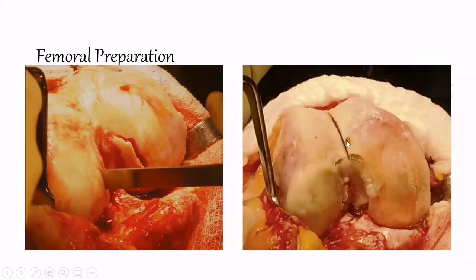This is the point that we drew with the preoperative alignment in the previous lecture. In the previous webinar, we suggested that on the previous X-ray, in the sagittal plane or lateral view, we draw the anatomical line of the femur that will not intersect the Blumensaat line. So from the anatomical line on the lateral view, we measure this distance, and it will be either 7, 8, or 10 millimeters from the Blumensaat line, which is the entry point of the femoral component or the cutting box.